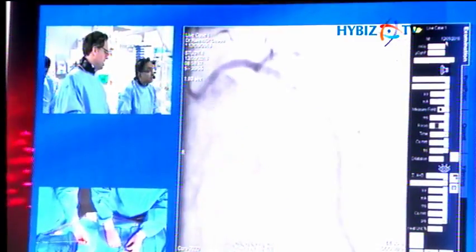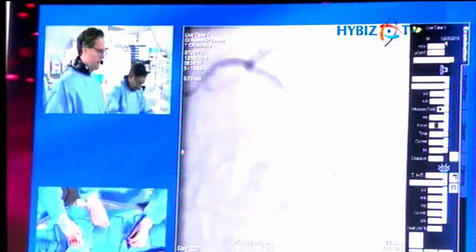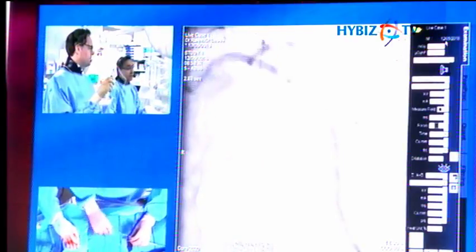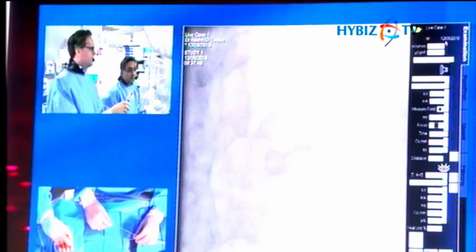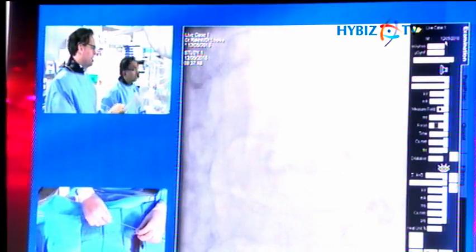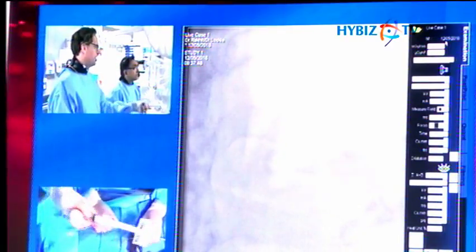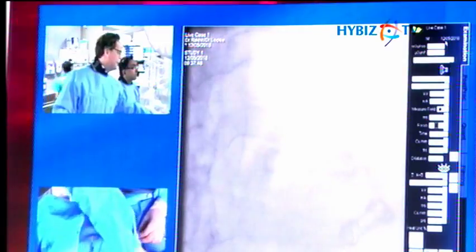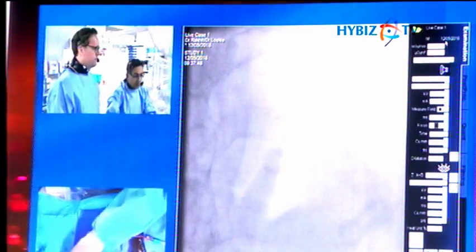We chose it for several reasons. First of all, the anatomy of the region. I think it's very unpredictable how you're going to get a good result with a conventional balloon expandable stent. When we take balloon expandable stents up to around 6 millimeters, you get a loss of stent integrity, loss of deformation, loss of expansile strength and support, and prolapse of tissue. Although it is possible, I think the optimal result here from a dedicated device would be much more favourable.